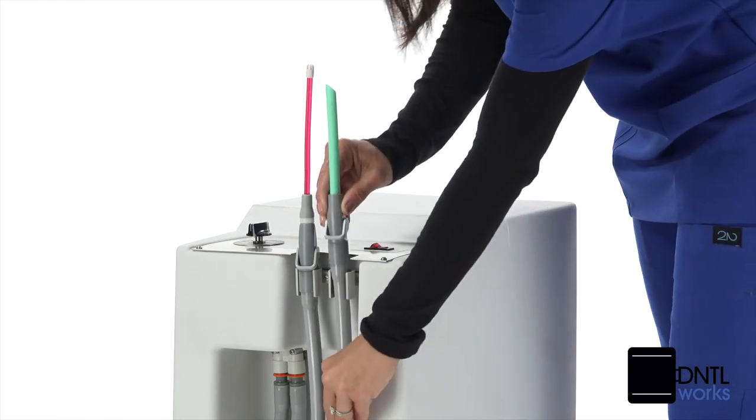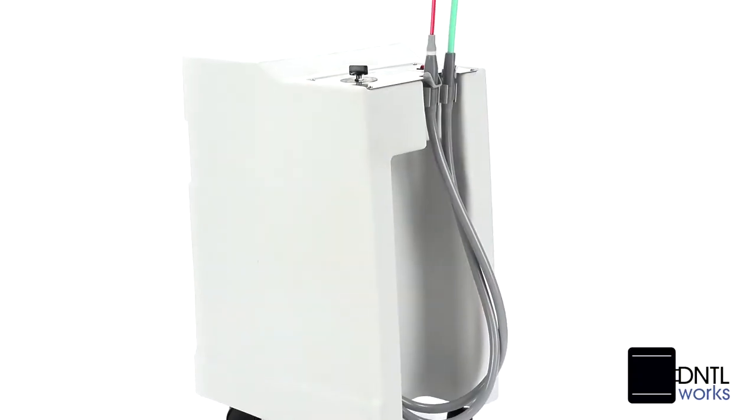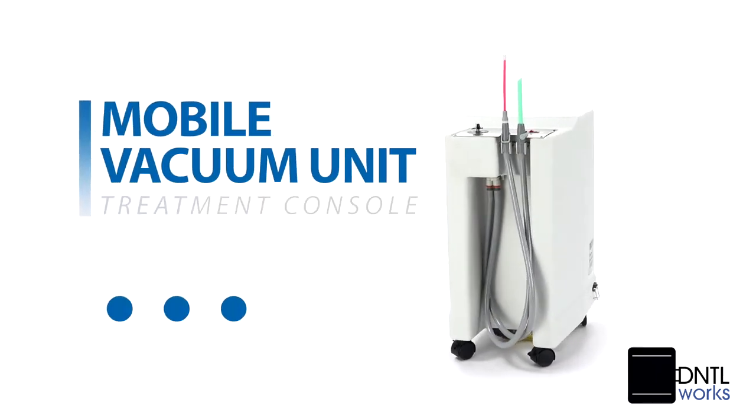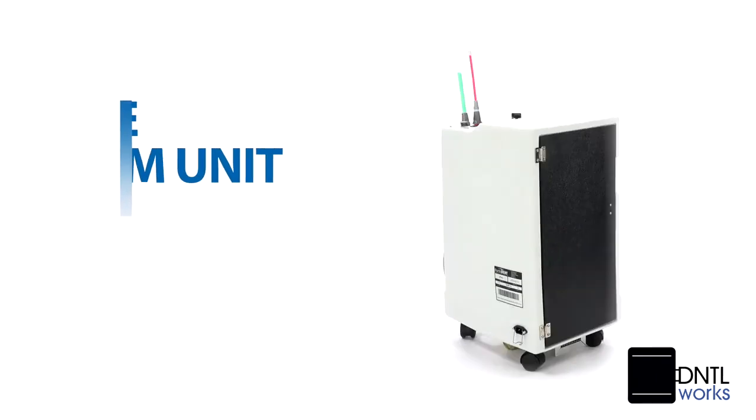Easily the least expensive of oral evacuation units, the Dentalworks mobile vacuum is no obstacle at chairside and inconspicuous when in storage.